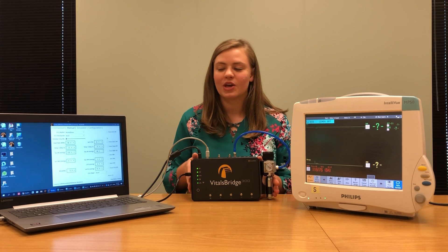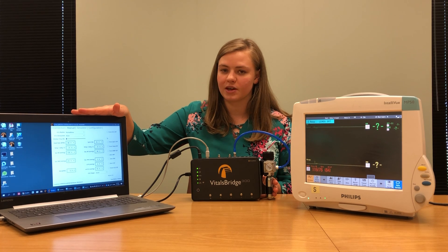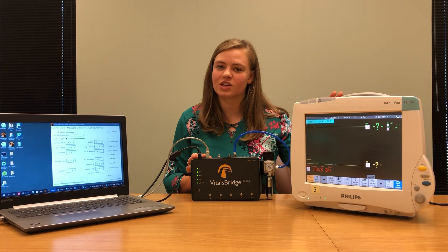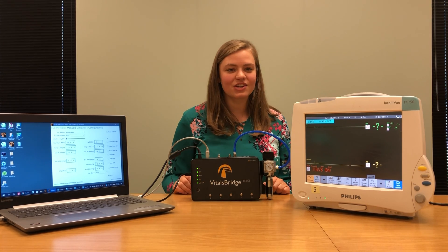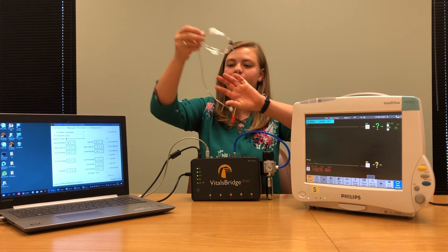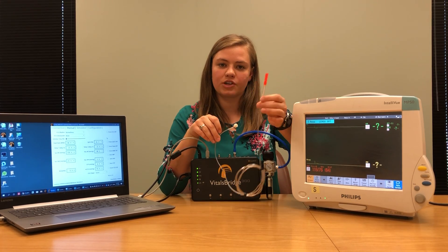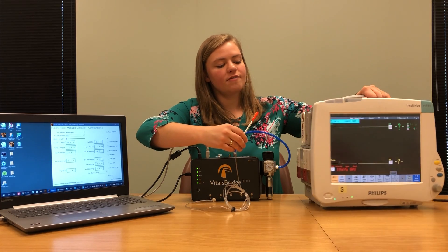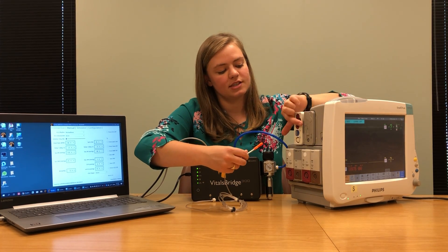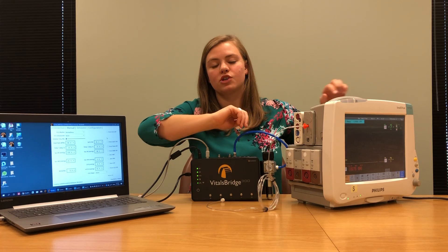Once you have your VitalsBridge on and set up, you can connect it in the VitalsBridge connector software. Once connected, vital signs will be sent from the computer connector software to your VitalsBridge. This is important to have on while we set up our patient monitor so that we can check each vital sign as we make the connections. Let's begin making our connections. The first connection we're going to make is our carbon dioxide and capnography connection.